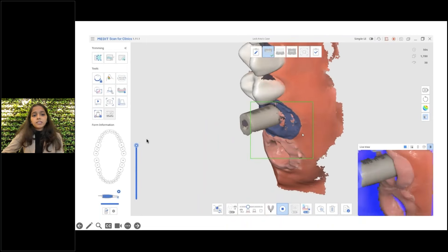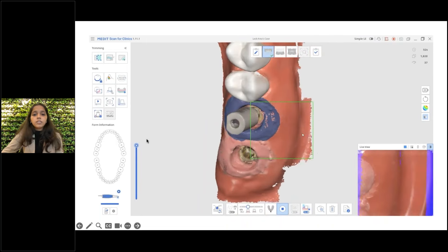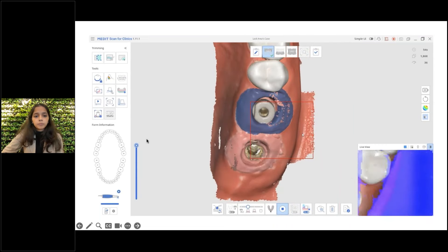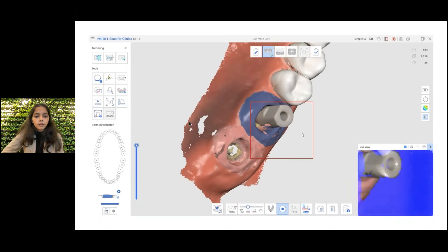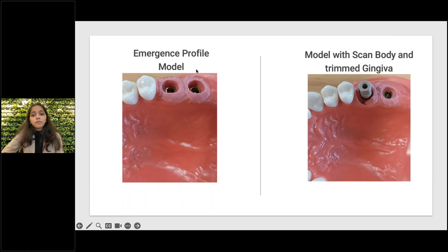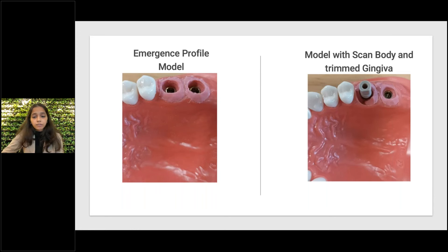It is only scanning the scan body. This way you can use the lock area tool to safeguard your data. Just to clarify: two models were used in the last video — one with the good gingiva or emergence profile, and the second with the trimmed gingiva. The second scan was performed on the trimmed gingiva, but because we had locked that part, it did not overwrite the locked gingiva area.